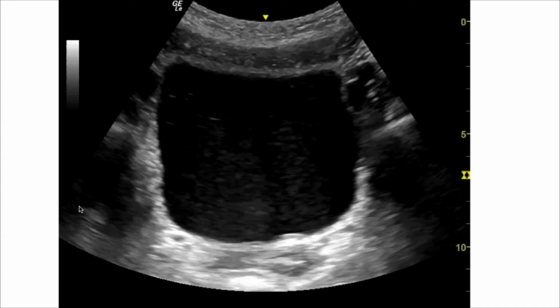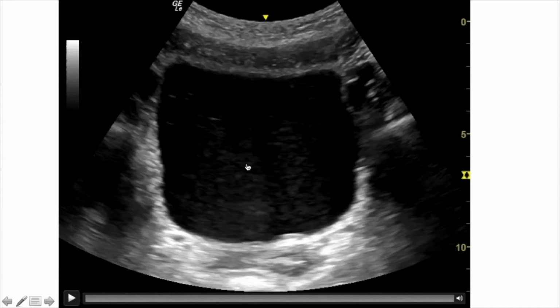So here we have a video of a normal pelvic floor contraction. This view is a transabdominal view, and you can see our nice bladder here. Our levator plate will be underneath here. Again, you see the anechoic bladder and the hyperechoic shadowing that's underneath that fluid-filled structure.